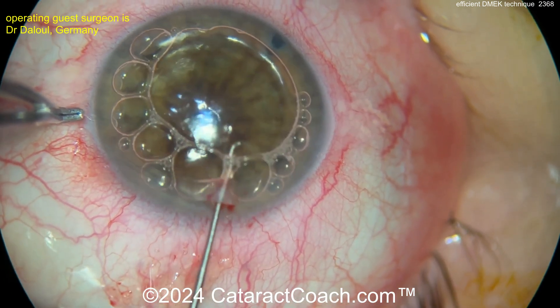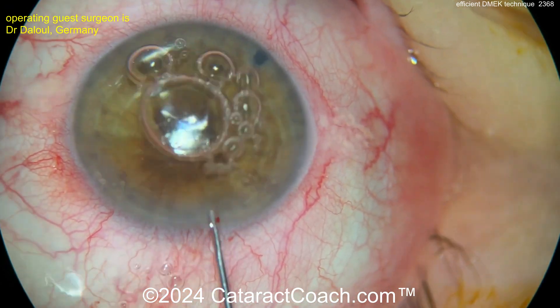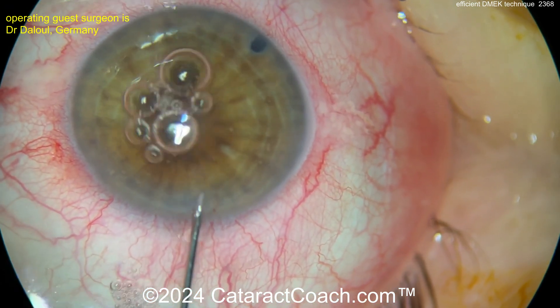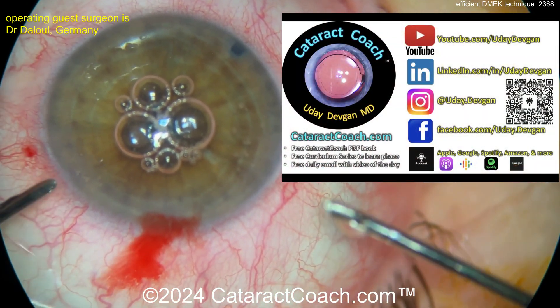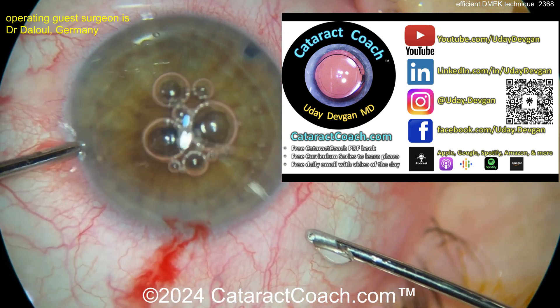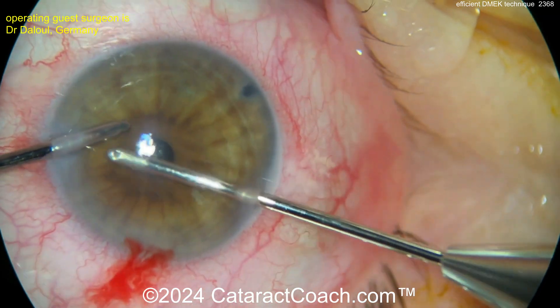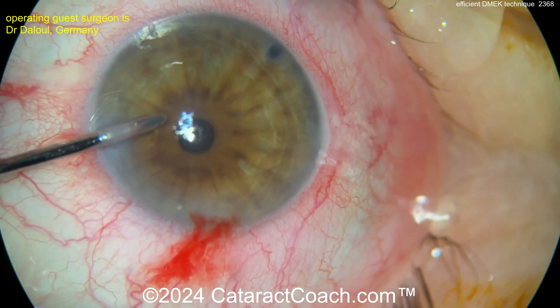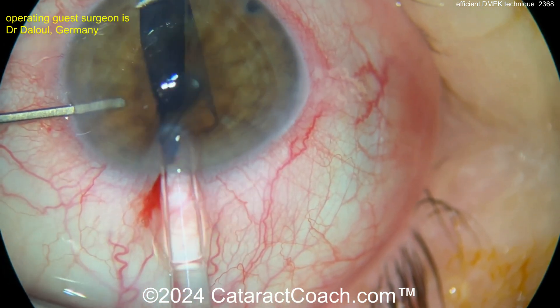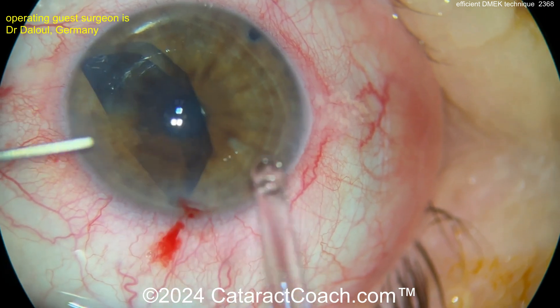They're getting out the host tissue there, and now coming in for the graft. Just a little bit of BSS going in first — be careful in doing this. Remember to check out the Cataract Coach podcast, the top podcast in all of ophthalmology — it'll teach you to be a better surgeon. When we're doing this, you get the graft in and it can easily fall right back out the main incision, so you want to be very careful in placing it. Then use the paracentesis to flatten the AC a little bit.